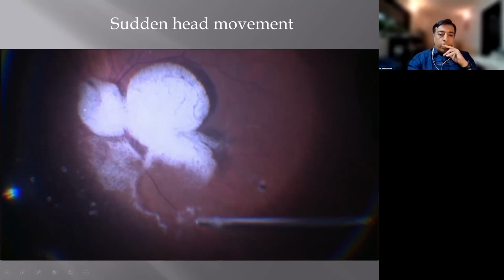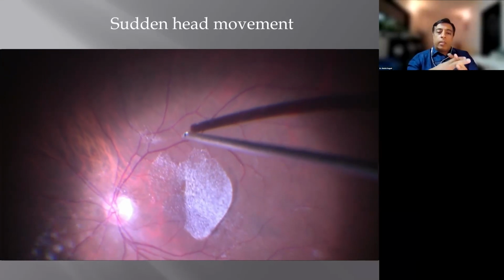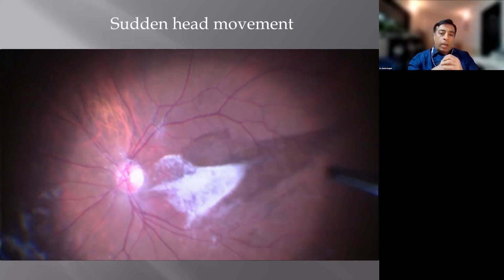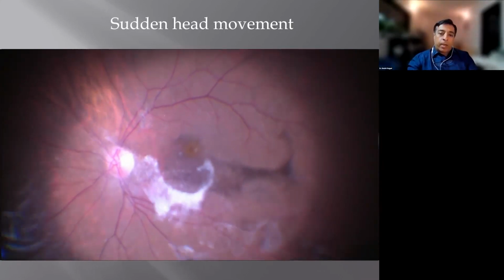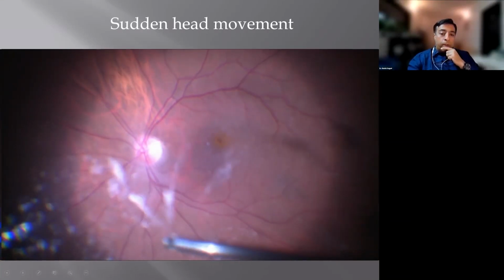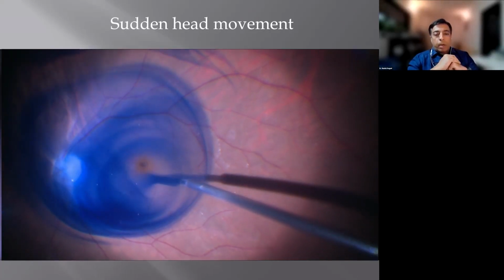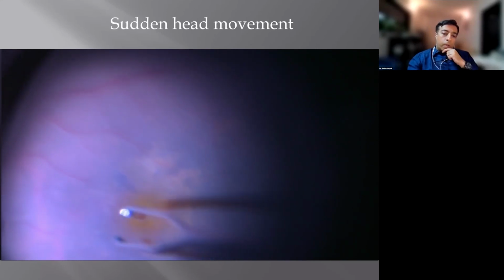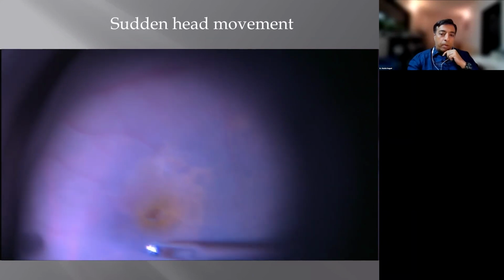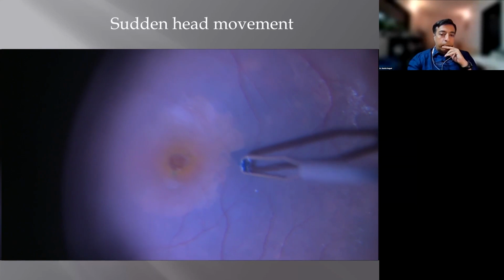So this is a patient where we are doing a macular hole process, and wanted to show you that as patient suddenly is sleeping and decides to get up and doesn't know what happened, and his head moves. And in this particular patient, something like that had happened, where the patient was sleeping, and at some point during the surgery, I was peeling, and this is a time that you want to have very good magnification and stability, that the patient doesn't move the head at such a point of time.